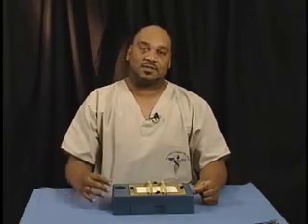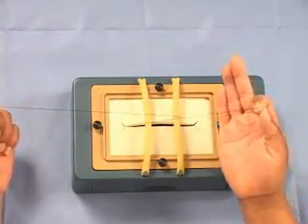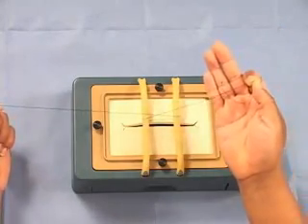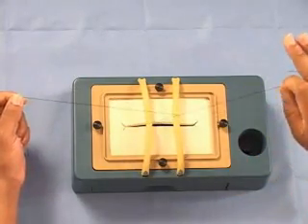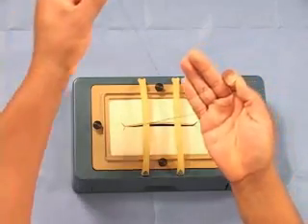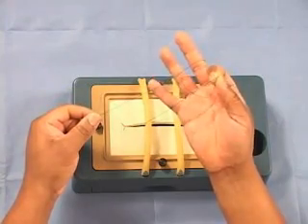Let's also look at this hand position. We call it the OK position. If you hold the strand between the index finger and thumb and let your pinky rotate in and hit the strand, then you're holding the strand in the correct position. Notice that the near strand is in my right hand and the pinky is now touching the near strand. The far strand in my left hand rotates over the three fingers.